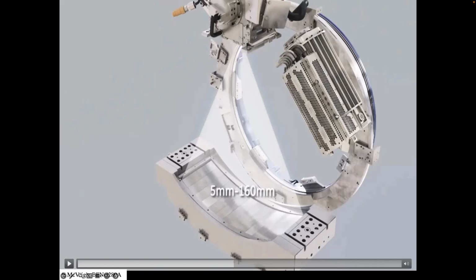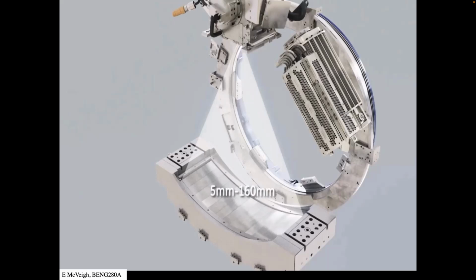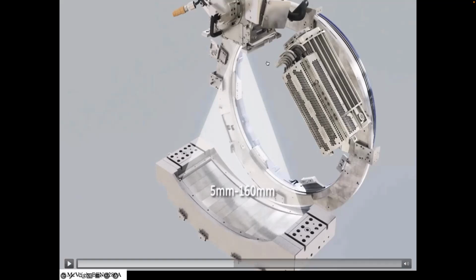This power supply is a really special one. It can flip between 2 voltages in sort of the kilohertz range. So it'll do 80 kV across the tube and then flip to 140 kV and then flip back to 80 kV and 140. And so the image you get is interdigitated energies, right? And so it's kind of like simultaneously dual energy imaging. So you take all of your 80 kV data, make a picture, take all your 140 kV, take a picture. And it's basically taken at the same time. So they went deep into that engineering territory to make an amplifier that could do that, right? To produce enough X-rays.